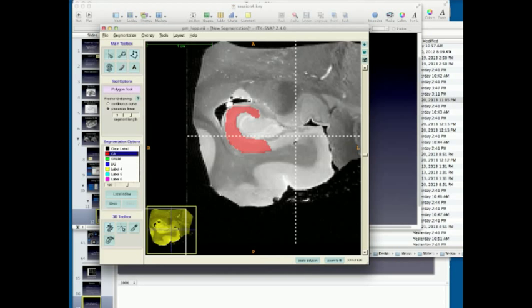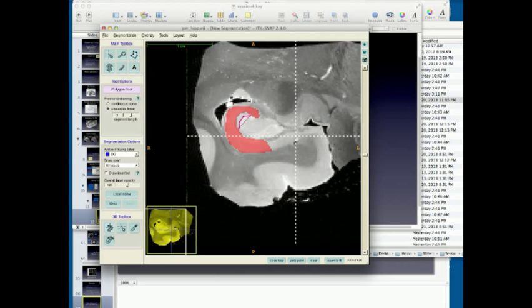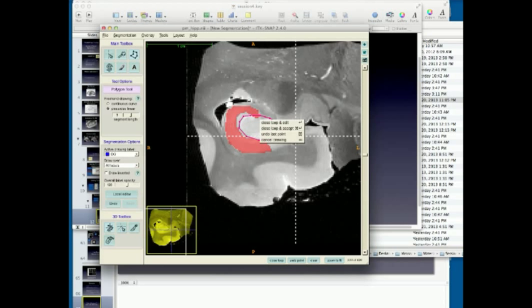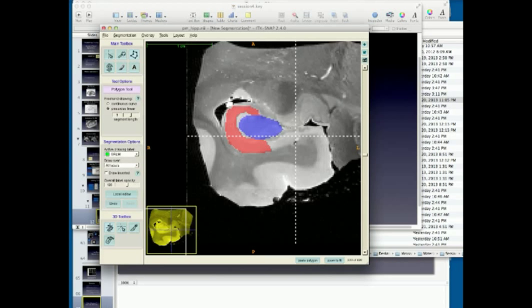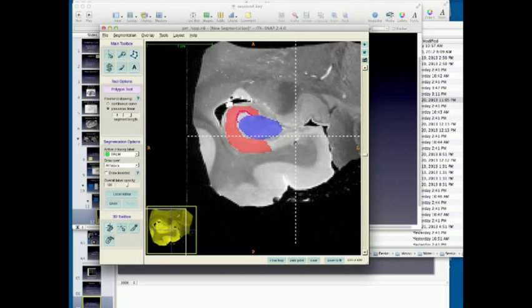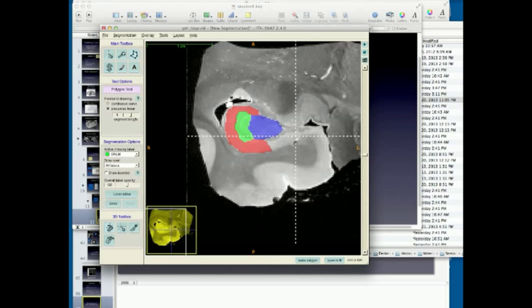Then you can either, if you're not happy with it, you can clear the polygon and try again. Delete selected points will remove some of these points and connect those two lines. And if I hit accept, this will fill in the area with the label I have selected. So to show you again, I can quickly do the dentate. And then we want to fill in the SRLM in between the two. So here's what I'm talking about with the active drawing label and draw over. So right now, the active drawing label is the SRLM, and I want to cover this area in between the two, in between dentate gyrus and CA. And right now I'm drawing over all labels.